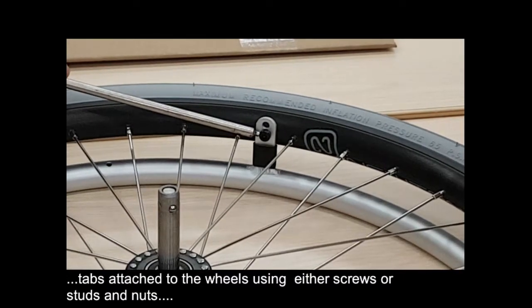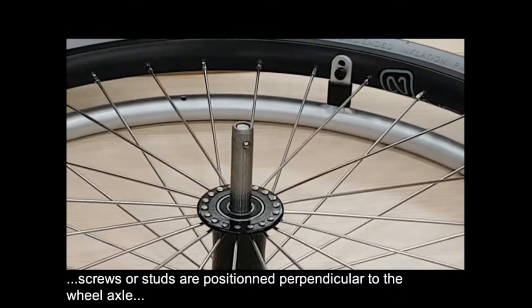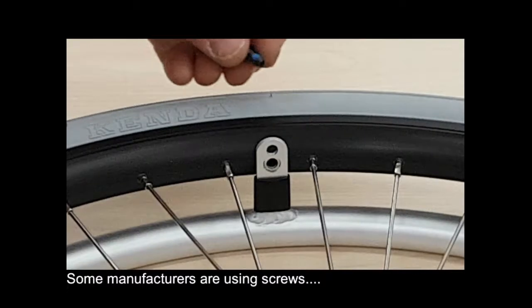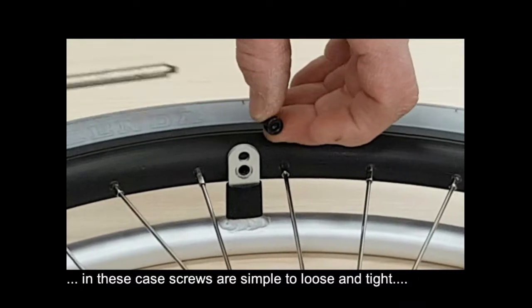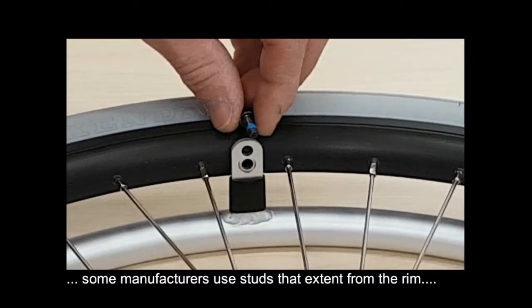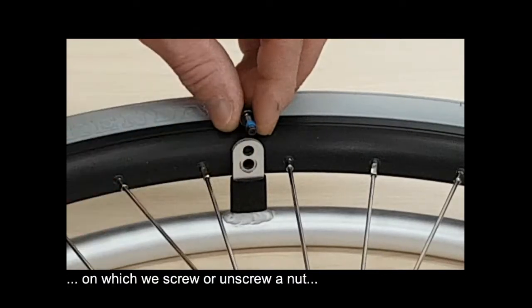Tabs are attached to the wheels using either screws or studs and nuts. Screws or studs are positioned perpendicular to the wheel axle. Some manufacturers are using screws. In these cases, screws are simple to loosen and tighten. Some manufacturers use studs that extend from the rim on which a nut is screwed.